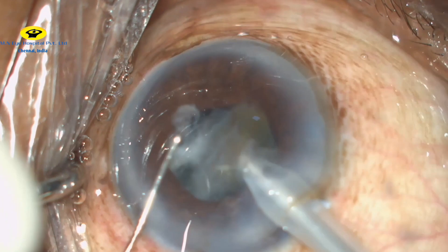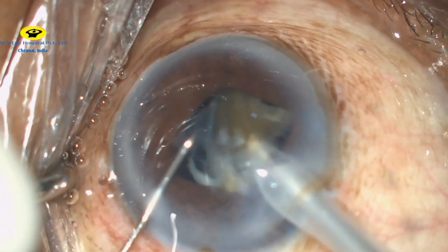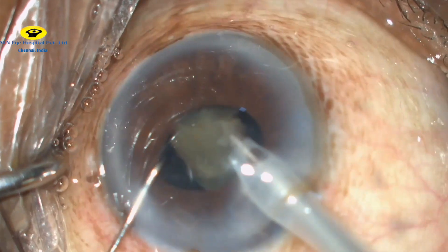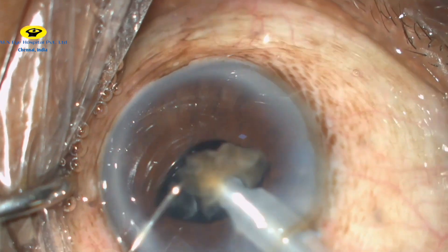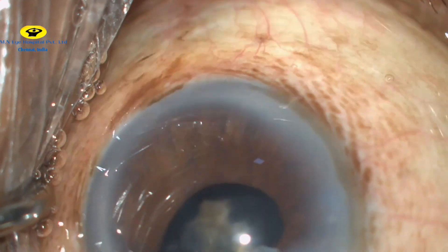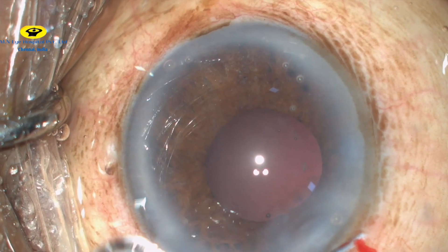Special care should be taken in such cases to avoid excessive contact of the phaco probe with the iris and to avoid undue stress on the zonules. We do not have any cortical remnants.